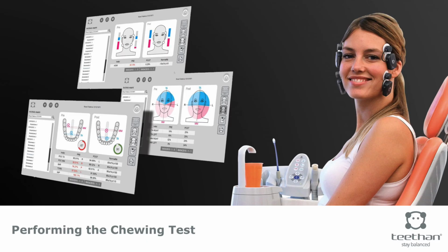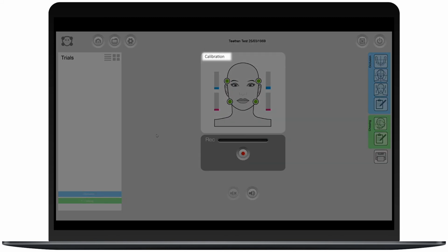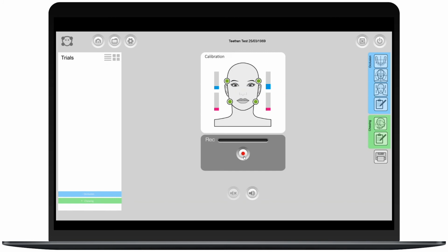Performing the chewing test. After inserting the receiver and activating the probes, it is necessary to carry out a calibration test, as we did for the static occlusion test. For the calibration, it is recommended to carry out at least 2 tests to ensure repeatable data.